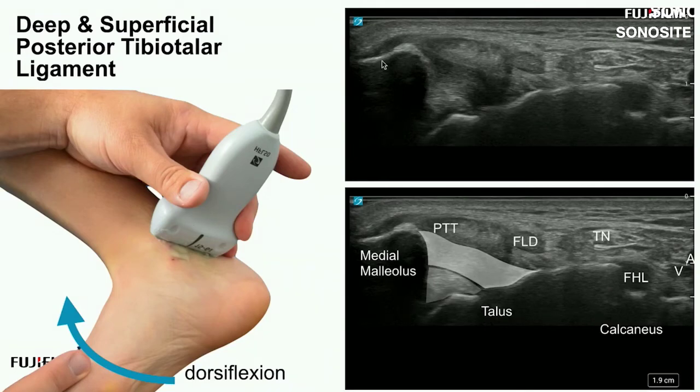Here's the transducer position and the ligament. You won't see this with a relaxed ankle — the ligament is tucked and hiding under the medial malleolus. We need pretty exaggerated dorsiflexion. Keep part of the transducer planted on the medial malleolus and watch for the talus to mobilize. You should see the subtalar joint swing into view as a landmark, with the FHL in the back. The superficial and deep layers do blend together — they are a complex, so don't get too hung up on delineating them. In the live scan today we'll go over that.